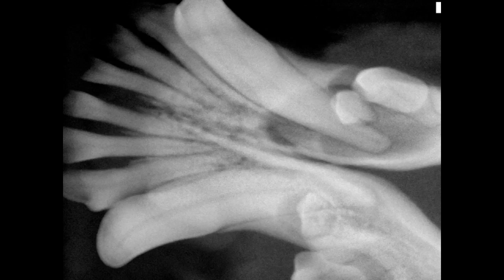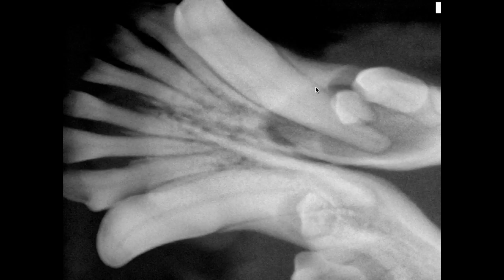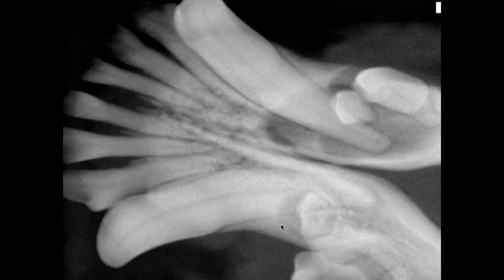Radiographically we can see that there's a lucency that's extended fairly significantly into that rostral mandibular bone, encompassing the canine tooth root. We can also see on the other side that we have an abnormal first premolar — abnormal shape — surrounded by a halo.